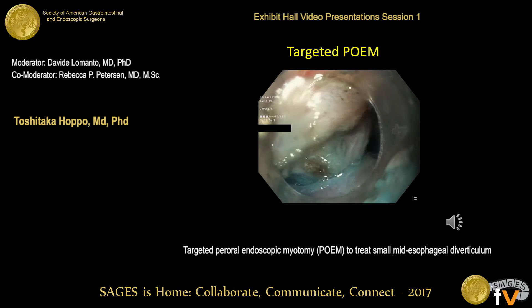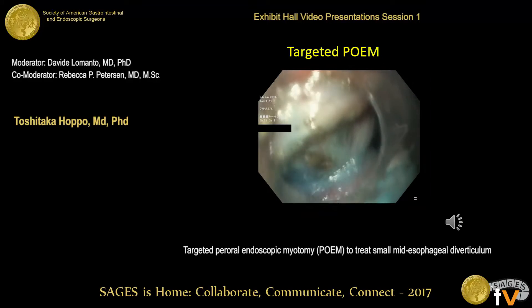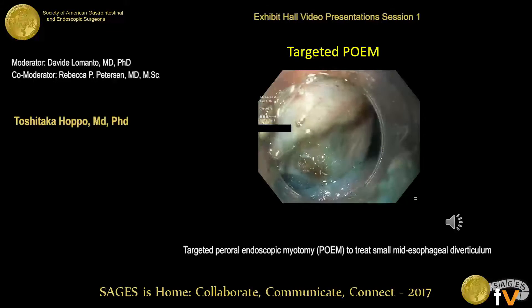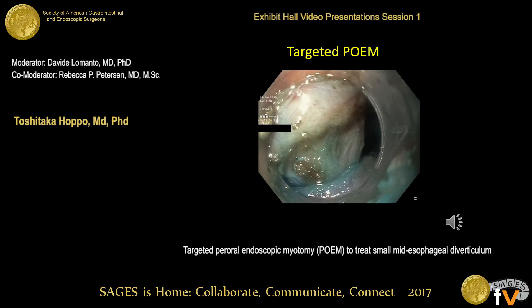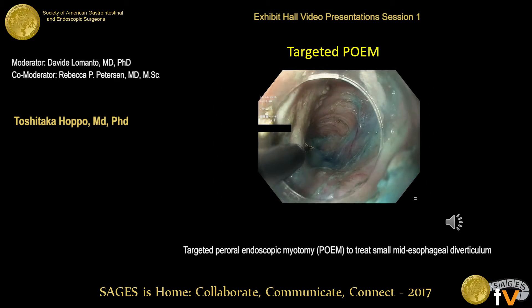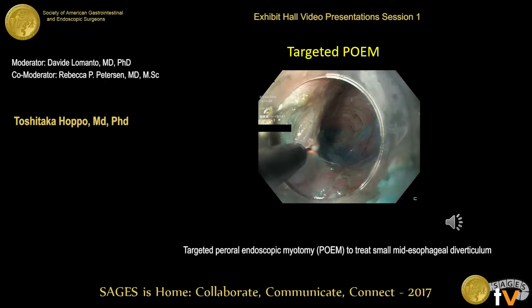As you can see here, the muscle band was easily identified. This is the submucosal space and this is the diverticulum here. You can also see the muscle layer extending to the diverticulum, which indicates this diverticulum is a true diverticulum.